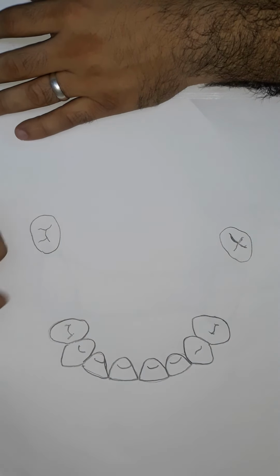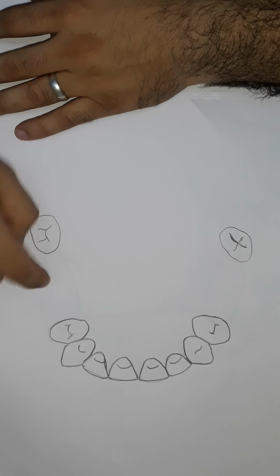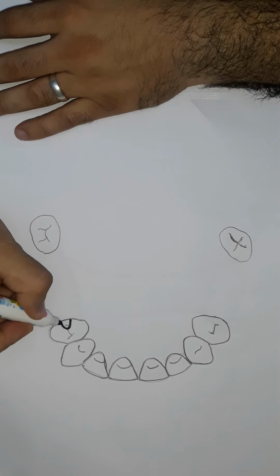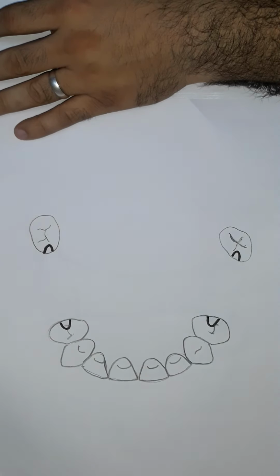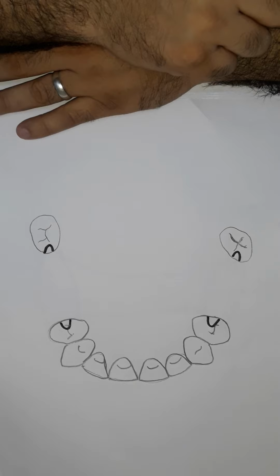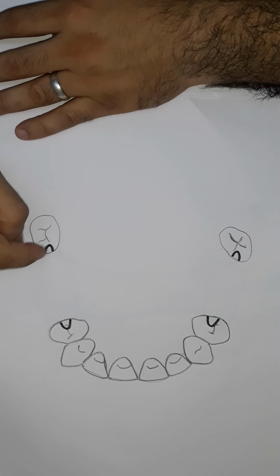Here we use the standard occlusal rest and we draw it with a black color for recognition purposes. You can notice the triangular shape of the rest with an apex directed towards the center of the tooth and base towards the marginal ridge.